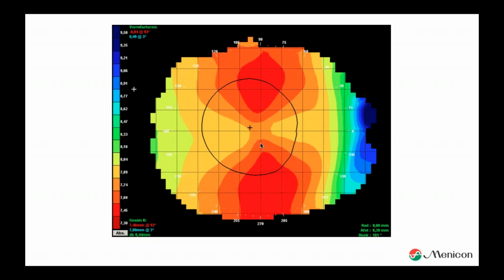And the topographer shows us several things. One of the things is that it shows us K readings. And fun fact, K readings, yes, we all rely on that these days, but in the future it will become less and less important for our lens fit if we just start using other fitting philosophies. But that's a future thing. But again, it is important to already understand it.